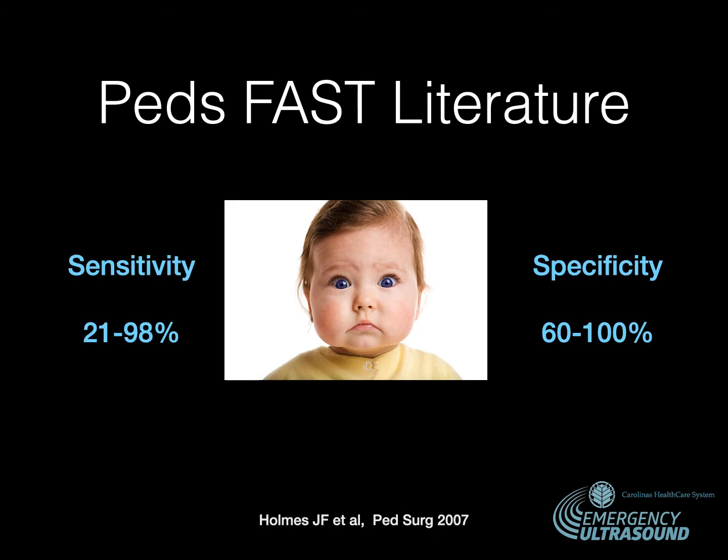In pediatrics, literature has quoted a sensitivity of 21 to 98% for the FAST exam and a specificity of 60 to 100%. Just be aware of some of the pitfalls in relying on the FAST exam for your pediatric patients.